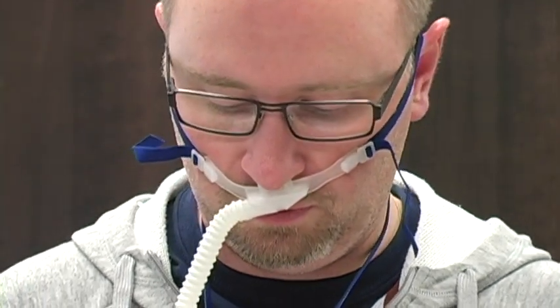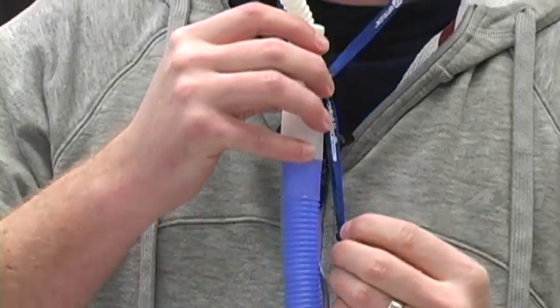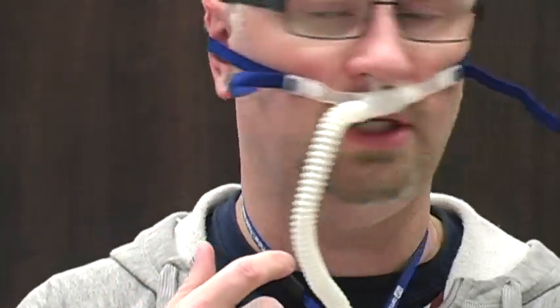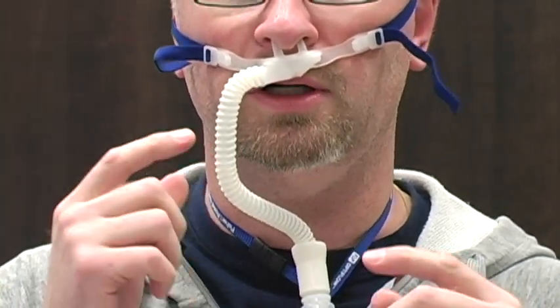Now you can kind of see right now I've got some tugging on here. What you want to do is grab this lanyard and pull it nice and tight. What you're looking for is a letter C. So now I can turn my head and I've got room to do that. You don't have weight pulling on the prongs themselves. There shouldn't be weight pulling on it. If that doesn't happen, then you get this kind of thing where it's pulling on them and you get a potential for a sore there. So try to remember the letter C and tighten it up there so you can kind of see what's happening there.